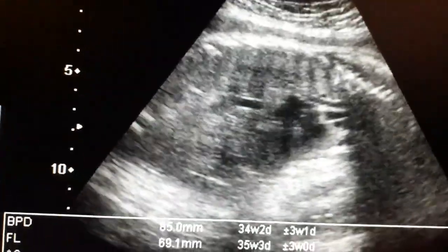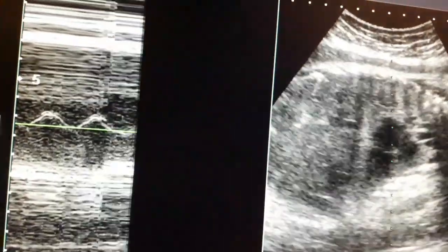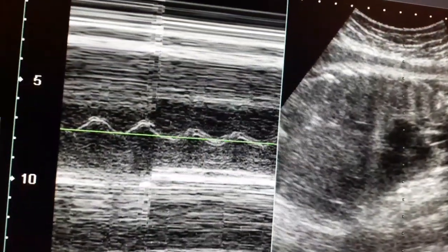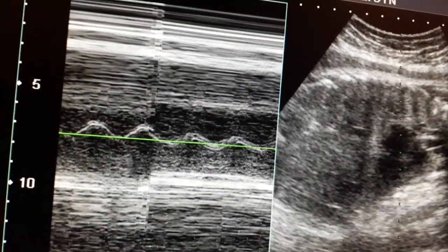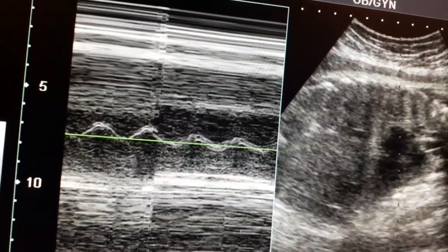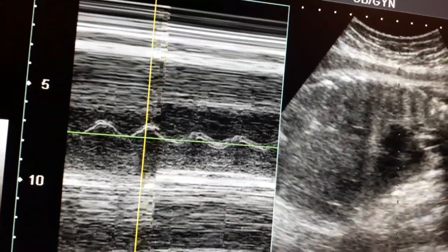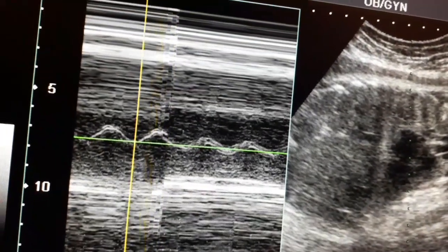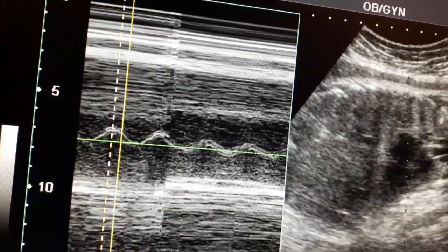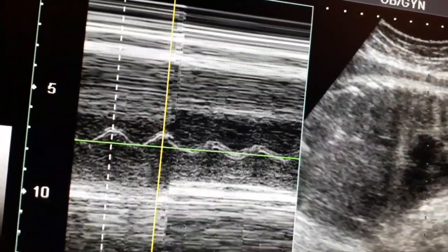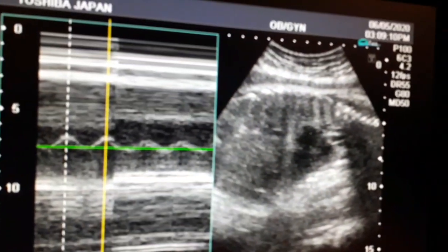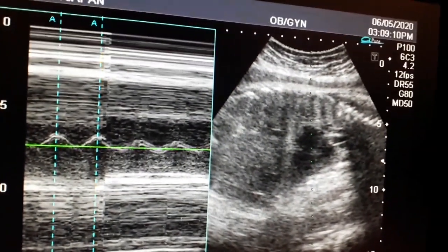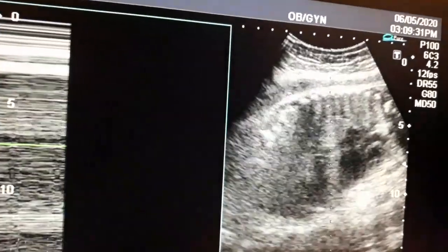Now I will try to focus on the four-chamber view of the heart. This is the waveform to calculate the heart rate. The approximate heart rate is about 150 beats per minute. We measure the waveform from the start of one wave to the next.